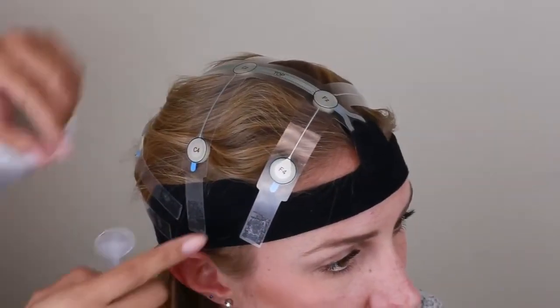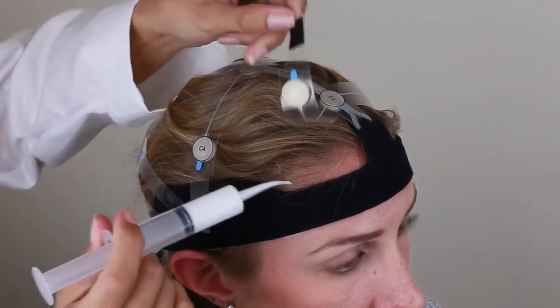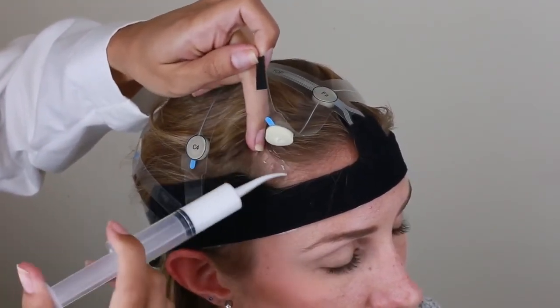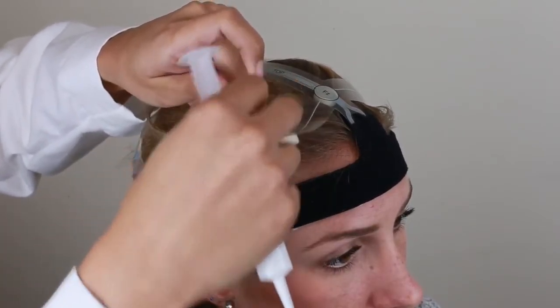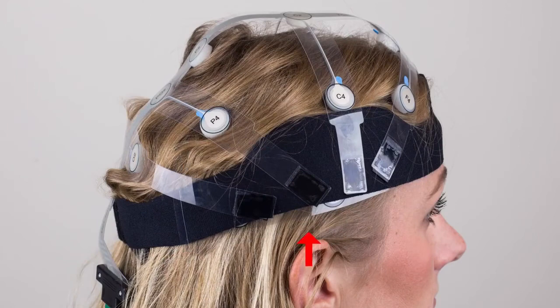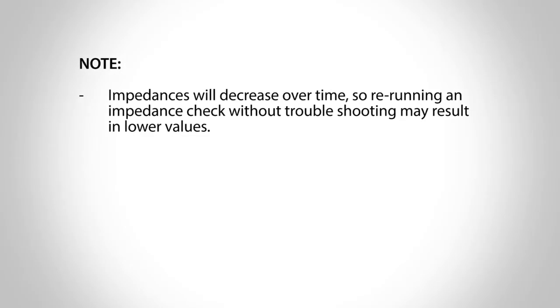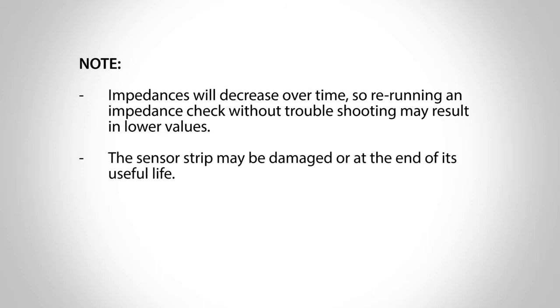If high impedances persist, locate the specific channels that appear red or yellow on the impedance check. Lift the strip arm tabs if necessary to access the sensor and use the tip of the syringe to part the hair and expose the scalp where the sensors rest. Add more Synapse Cream to both the foam sensor and the scalp site. You may need to re-wipe this area with an alcohol swab, then refill with Synapse Cream. If you observe that the strip arms are too tight, or that it is difficult to get particular sensors to lie flat, you may need to check the strip size measurements or troubleshoot other steps of the setup. Ill-fitted equipment could cause the strip to ride up on the participant's head, causing the foam connectors to disconnect from the scalp. Remember that impedances will decrease over time, so re-running an impedance check without troubleshooting may result in lower values. If no amount of troubleshooting seems to change impedance values, the strip sensor may be damaged or at the end of its useful life.